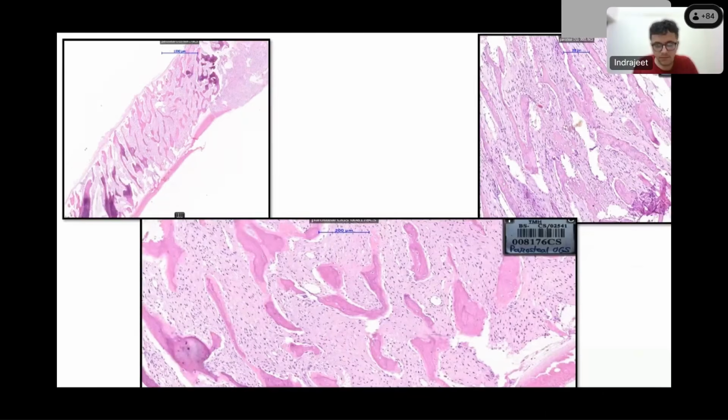So what I'm trying to tell you is that without radiology, without clinical context, our histology images or pictures don't make any sense, or you can be on a totally wrong track. This is one such example. So describe this morphology. What can you see here?